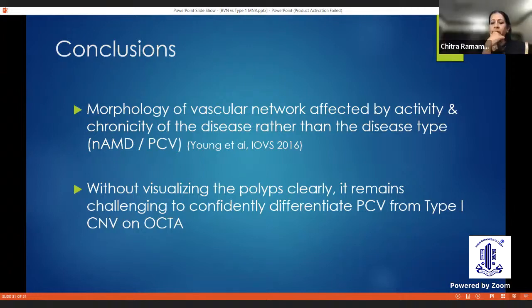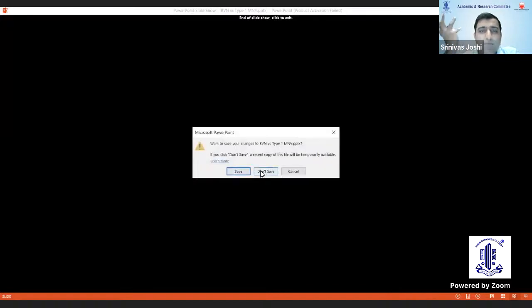Very nice talk, Jatinder. Srinivas, do you have a question? Yes, so Jatinder sir, very good talk. I would just like to know, when they say the signs of activity on OCTA, like the branching dense capillary network, the presence of anastomoses or loops, and perilesional hypointense halos, are these biomarkers pretty much similar in cases of PCV and CNV, or how do we look for the biomarkers in either of these cases?